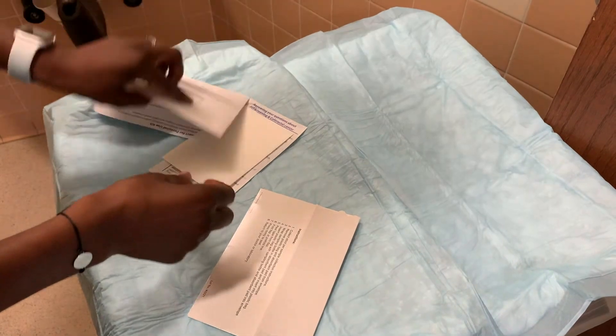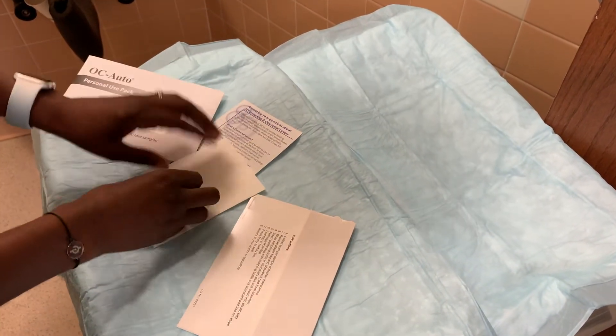When you get it, you want to open it and remove the materials. Khi bạn nhận được, bạn phải mở ra và coi hết tất cả những thứ bên trong.